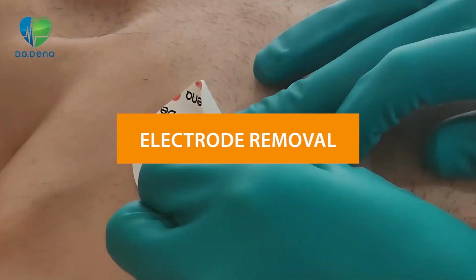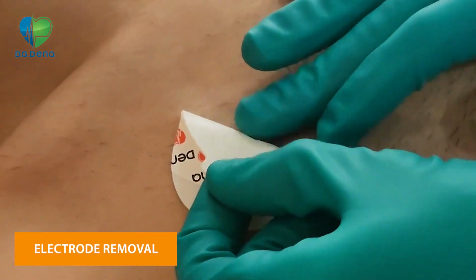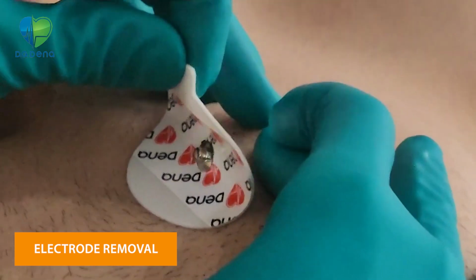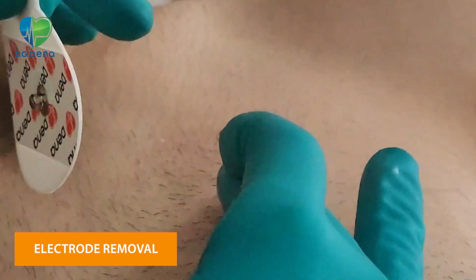Electrode removal. To reduce patient discomfort during electrode removal, gently peel the electrode in the direction of hair growth. To prevent skin irritation or damage, do not pull quickly or at an upward angle. Be sure to support the skin adjacent to the electrode during removal.